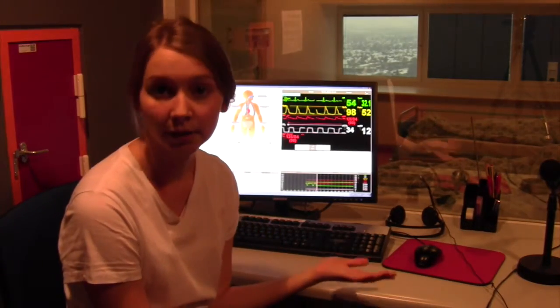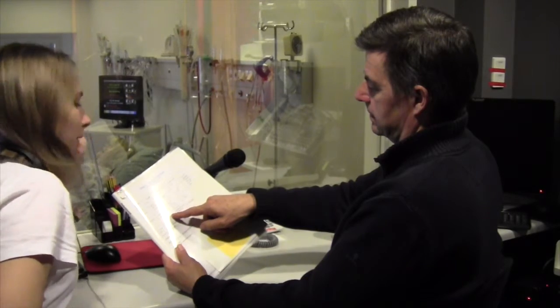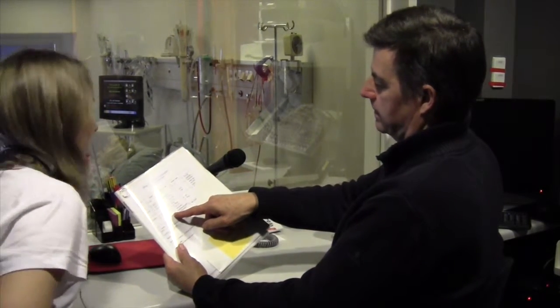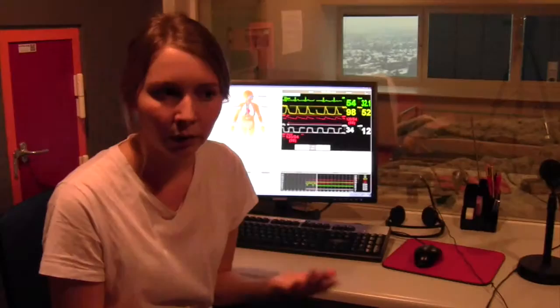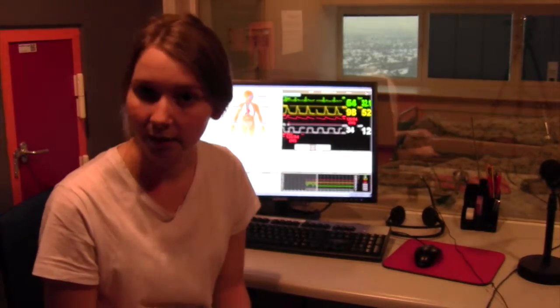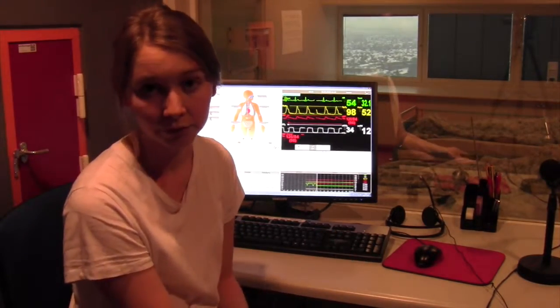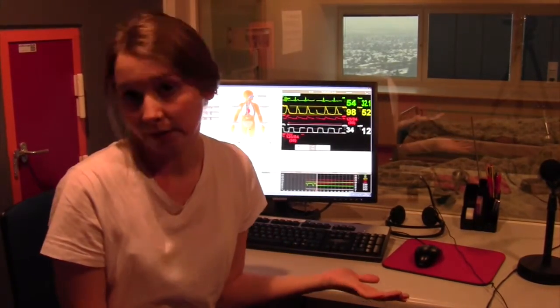Before you start a scenario, it's important to schedule with the facilitator what kind of scenario this will be. This includes the general structure of the scenario, what kind of patient we are assessing, what the start values should be, when the scenario will escalate and de-escalate, that is, when I will turn up and down the vital parameters, and the general time frame of the scenario.